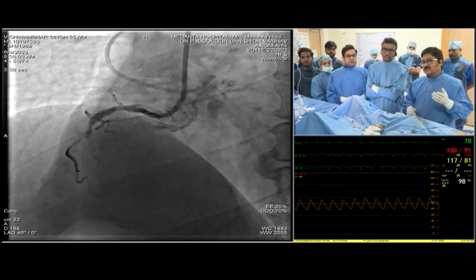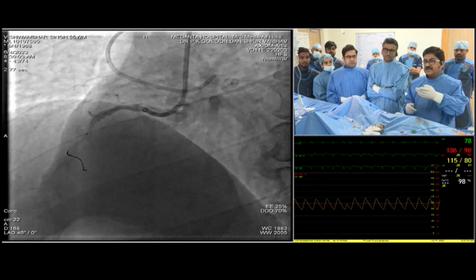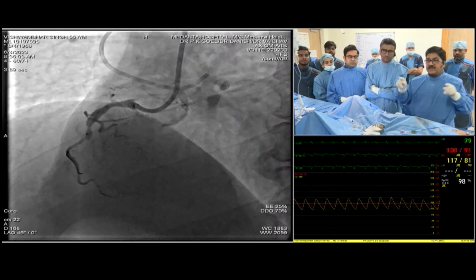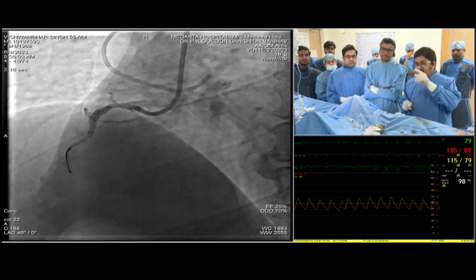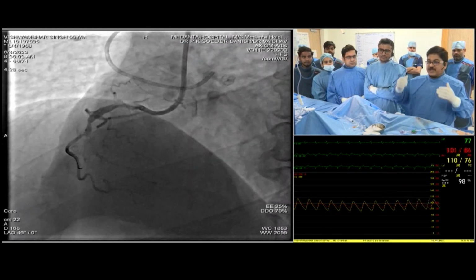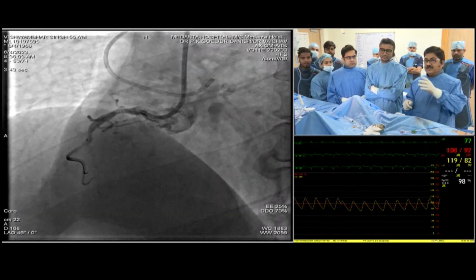Okay, so you want me to proceed with what we did in the case? So that is the IVUS, and I am pretty sure there were at least 2-3 channels which maybe you can't see from that distance, but when you see the angiogram from a close distance, frame by frame, then you know that this is a collateral channel. This is a bridging collateral. Okay. So that is how it was.